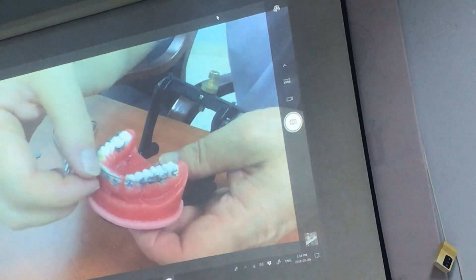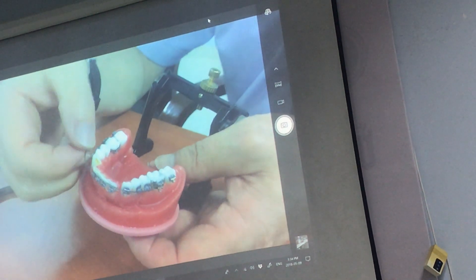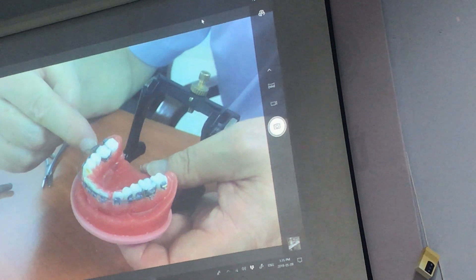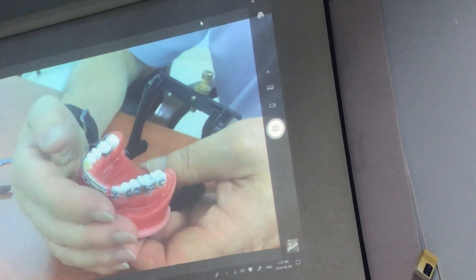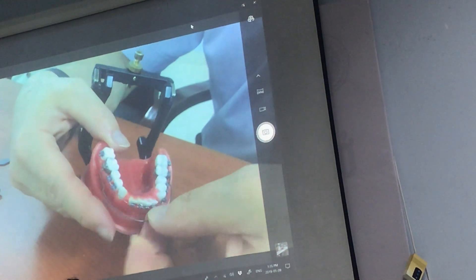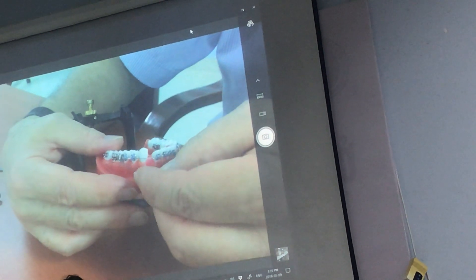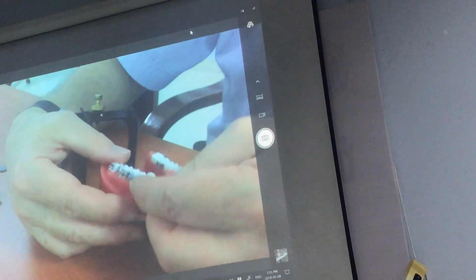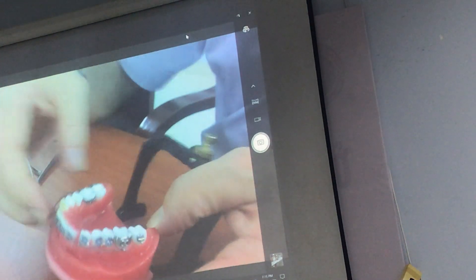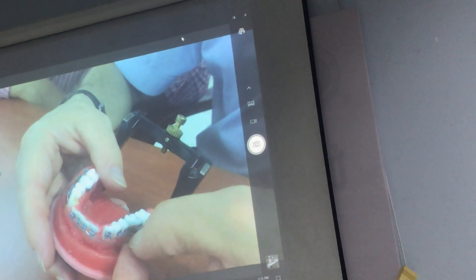So I'm trying this intrusion arch now on both sides. On that side there, when I have it tucked into place, it lies over here for me. And then when I try the other side — this is what you see to do when you're at the off-angle. So this again lies passive for me over here.